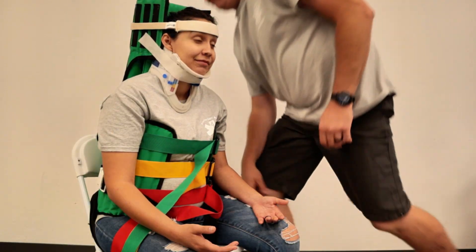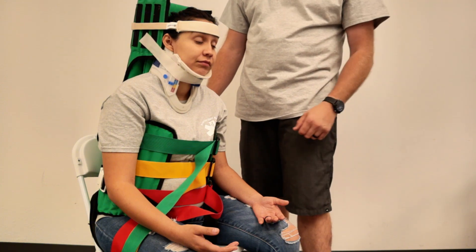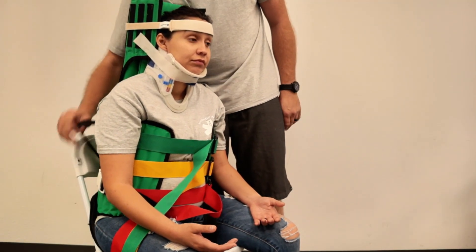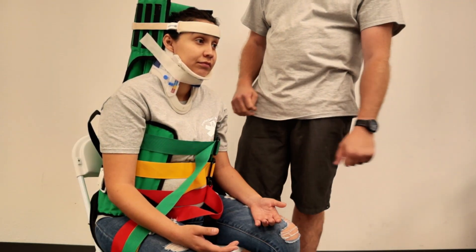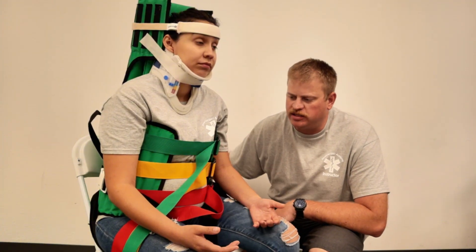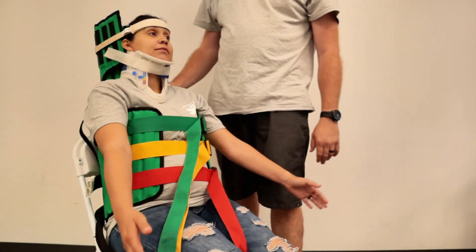Once we have that, you have your partner set up a backboard — it can be on your gurney already. Verbalize that we're moving the patient to the backboard. There are handles on here. Typically you pick up the legs, and there's a handle right here on the side. Grab that. They're already fully secured. You want to pick them up and put them down on the backboard. Once that's occurred and you've got them laying on the backboard, we need to release the white buckles here and let those just lay out on the backboard.